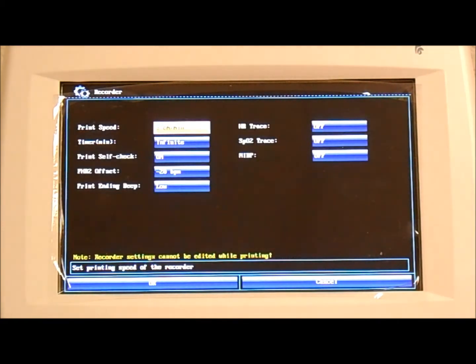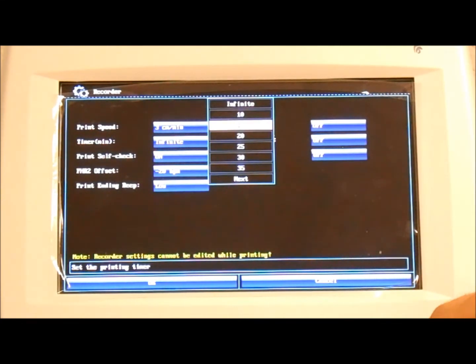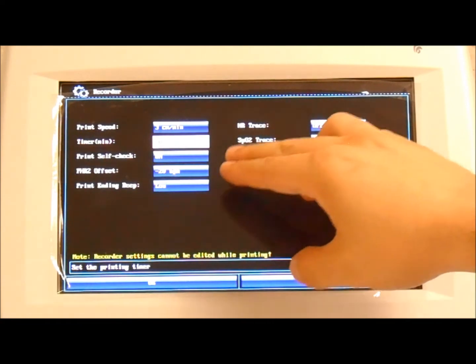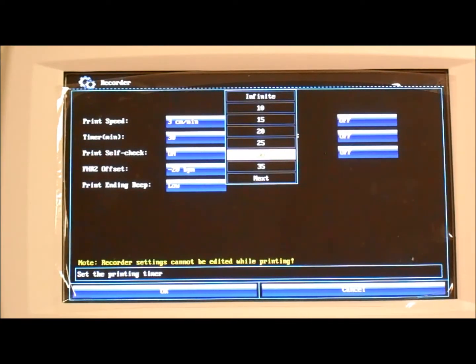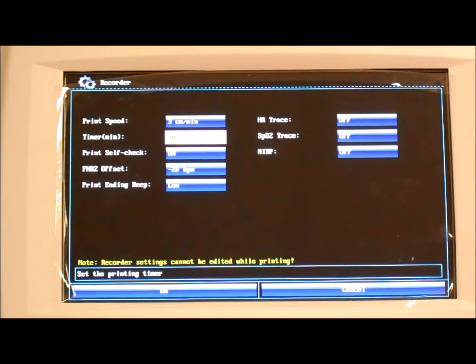Okay, next we have the recorder. We can set the print speed, which is 3 centimeters per minute, the standard setting, and timer. The current timer setting is infinite, which means that the monitor will start printing and keep going until you press the start key. But if you select a numerical setting, for example 30, the monitor will start printing, and after 30 minutes it'll stop by itself. So for the timer setting, if you set a numerical value, this is your time period. 30 would mean 30 minutes. The monitor starts printing, and automatically after 30 minutes it'll stop printing by itself.